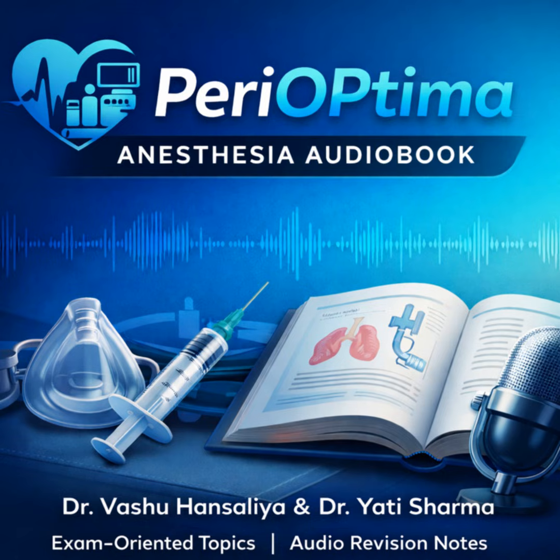Okay, and the second category? The indirect laryngoscopes, or ILs, these let you see the glottis using some kind of optical aid. It could be fiber optic bundles, mirrors, prisms. Or, most importantly for us today, video cameras. Right. Video laryngoscopes, or VLs, fall squarely into this indirect category.